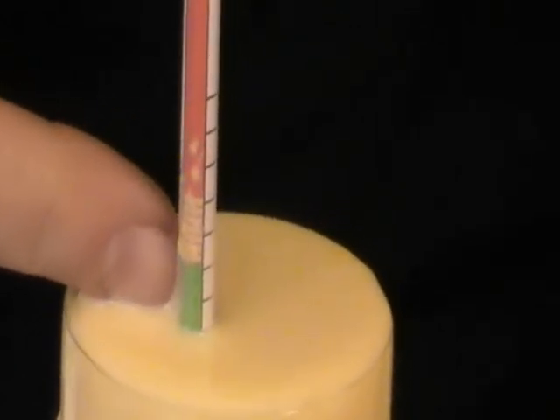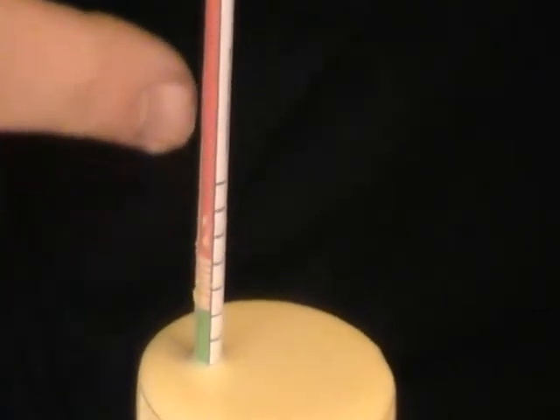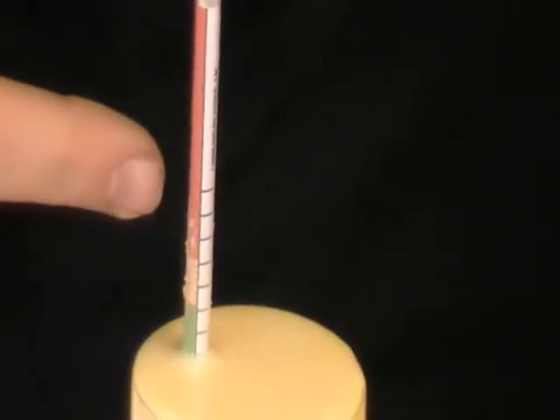It's important that you read the scale from right up the top of the cylinder. In this case, we can see that the colostrum is a very good quality and it's in the green zone, so it's perfect for feeding to the calf that's just been born.